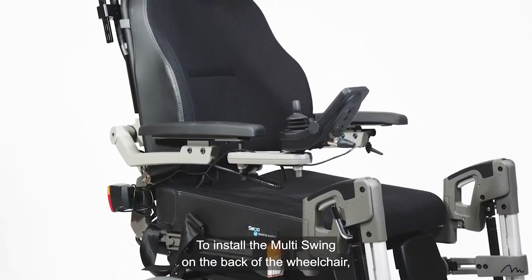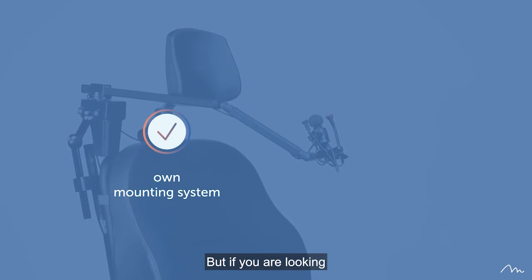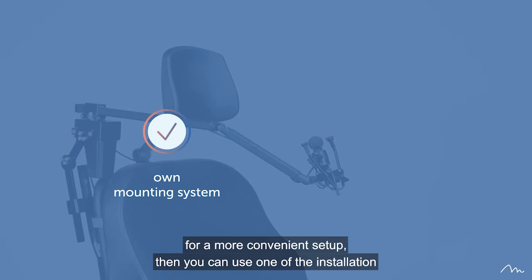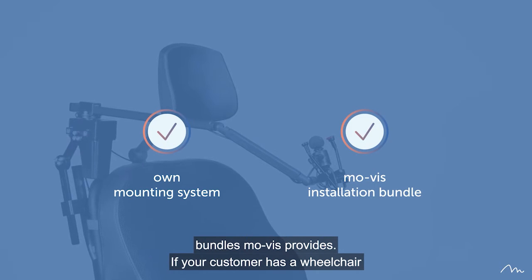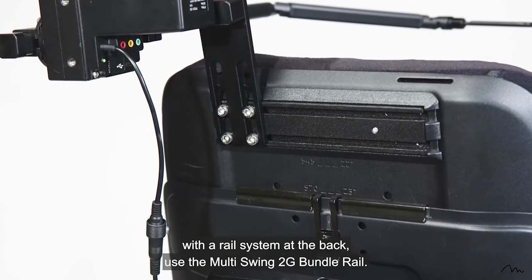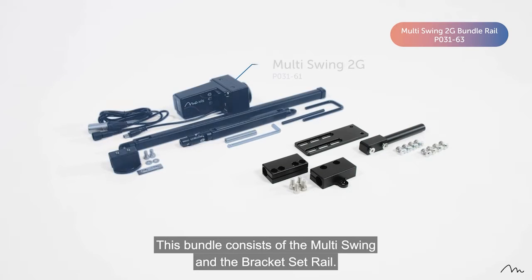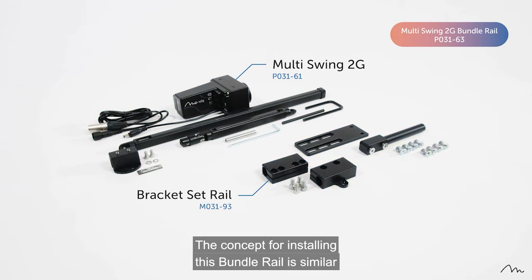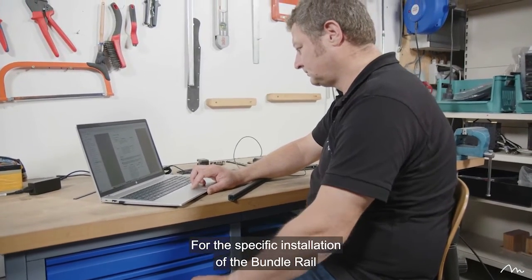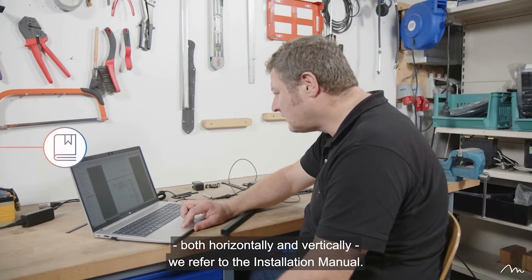To install the Multiswing on the back of the wheelchair, you can choose to design your own mounting system. But if you are looking for a more convenient setup, then you can use one of the installation bundles mo-vis provides. If your customer has a wheelchair with a rail system at the back, use the Multiswing 2G bundle rail. This bundle consists of the Multiswing and the bracket set rail. The concept for installing this bundle rail is similar to the installation instructions that will follow in this video. For the specific installation of the bundle rail, both horizontally and vertically, we refer to the installation manual.